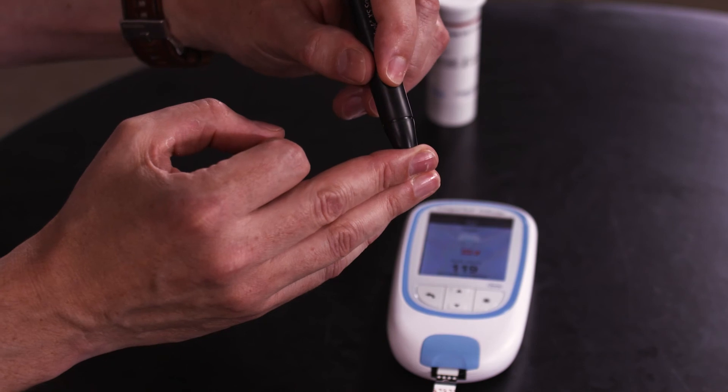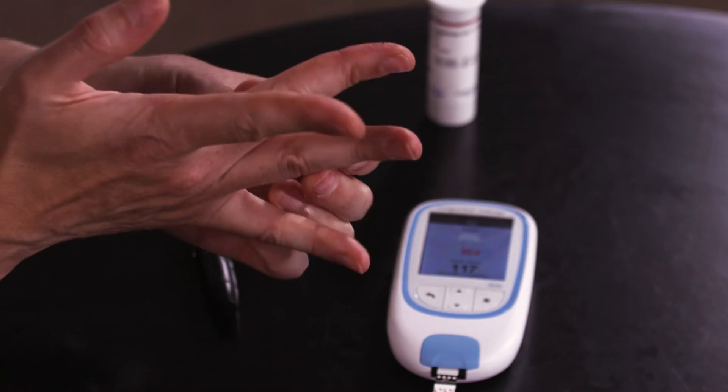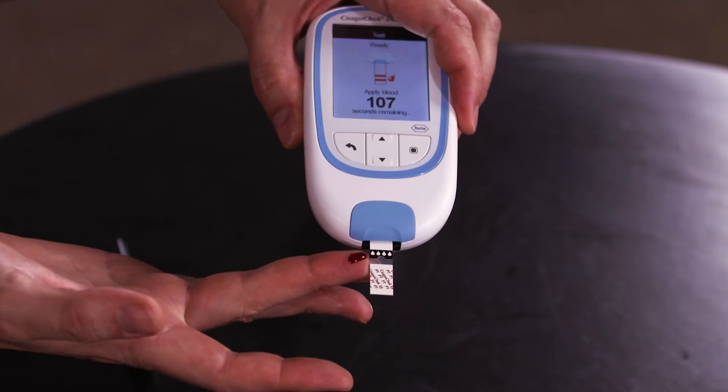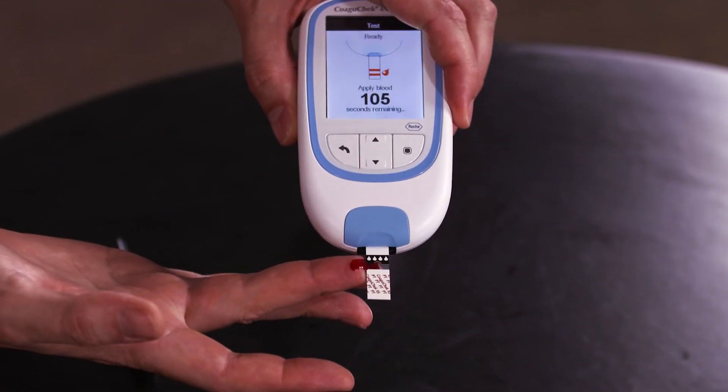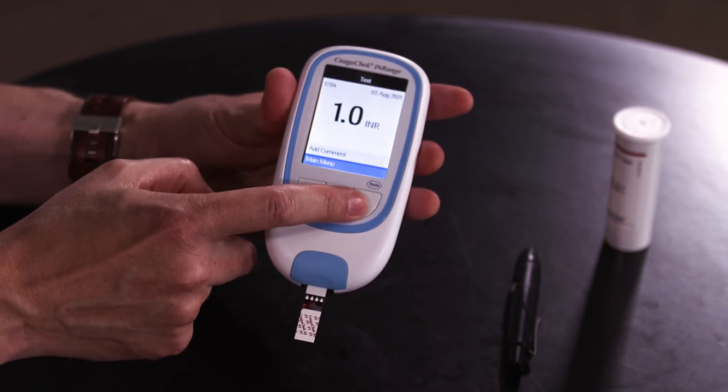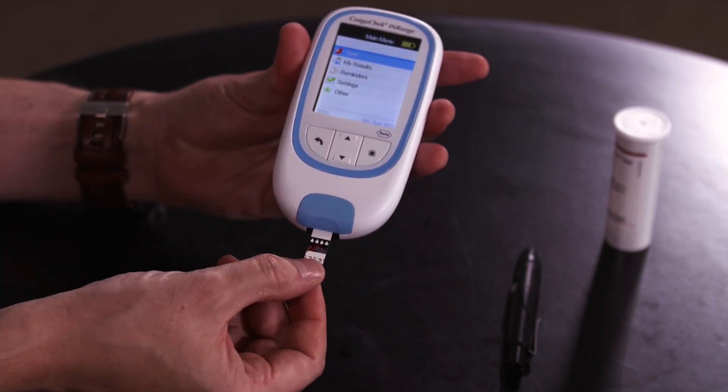To return to the main menu take the strip out and dispose of the strip appropriately. You can also apply the blood sample to the side of the strip. To apply it to the side of the strip, lance the top of the finger, massage to get a ladybird sized drop, and hold on to the side of the strip. When the result appears you can choose to add a comment or go straight to the main menu. Remove the strip and dispose of it appropriately.